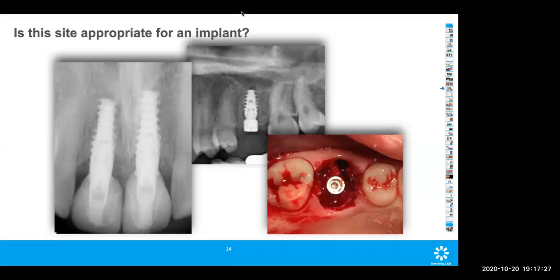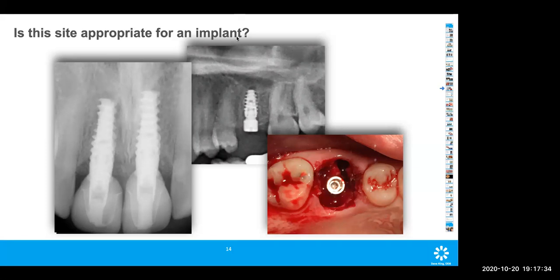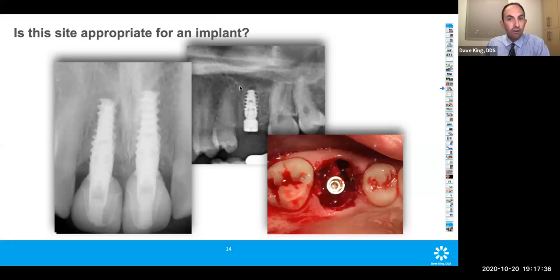We have a few more questions here. Sorry to cut you off. That's all right. Did you do a sinus lift in this case? So no, I did not. He ultimately didn't need it, and I think what we're seeing there is where the implant was placed. There were a couple of millimeters beyond where the implant was, where it was still solid bone. So it looks like it's into the sinus, but it's not here. So there was no sinus lift done here.